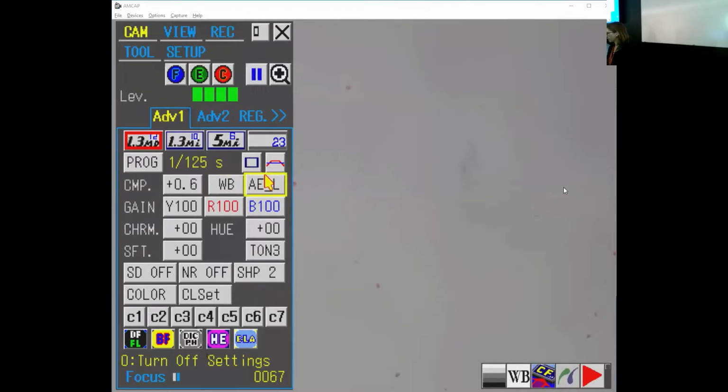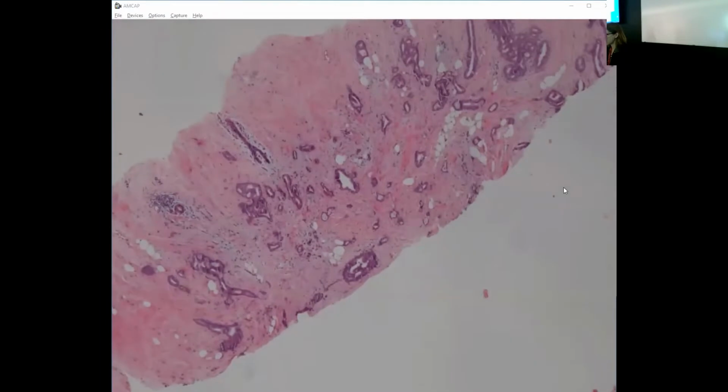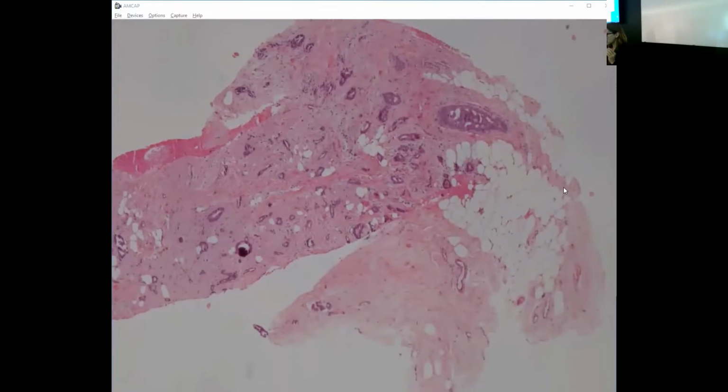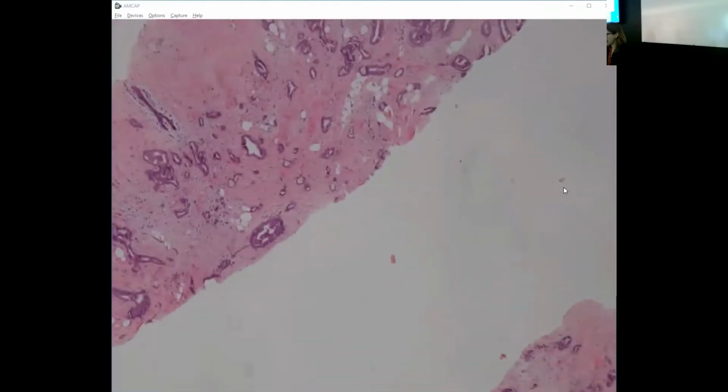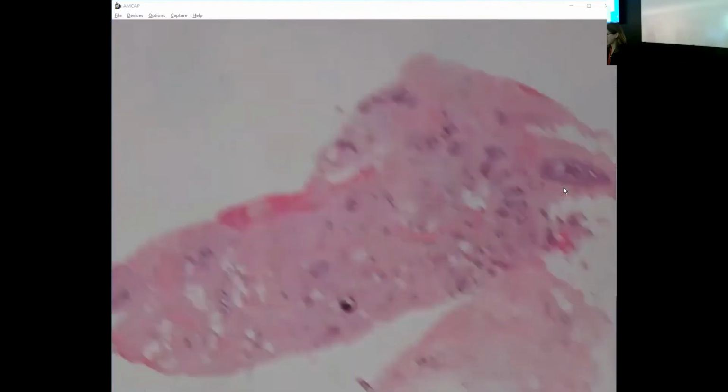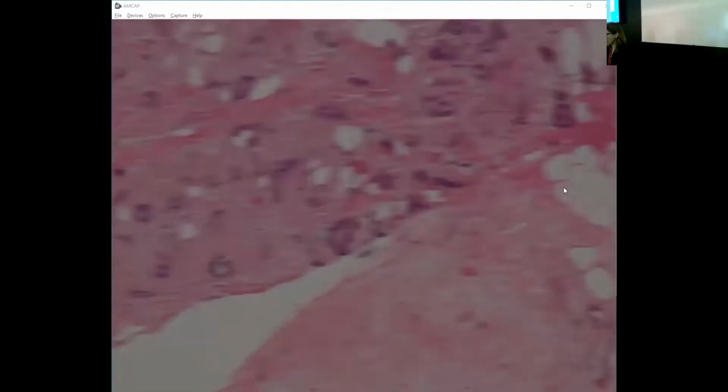Okay. All right. So tubular carcinoma, of course, is the archetypal small glandular proliferation that we use to benchmark our other ones. Tubular carcinoma has small angulated glands that infiltrate through the stroma in a haphazard pattern, obviously lacking a myoepithelial cell layer.